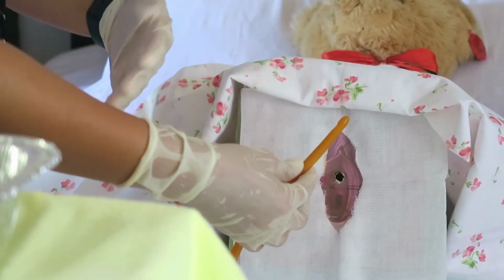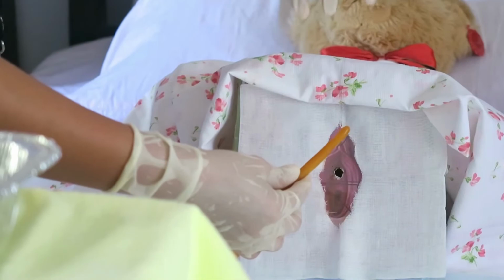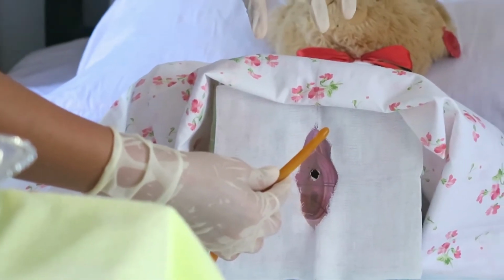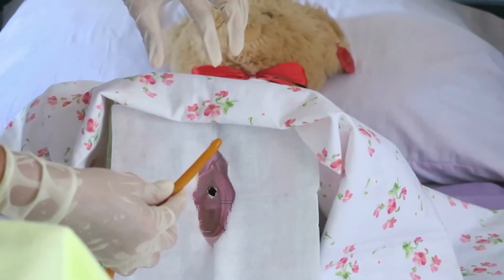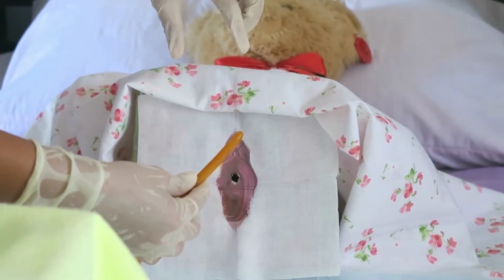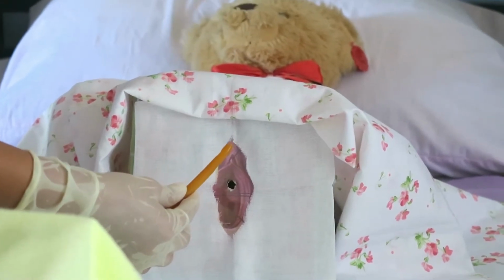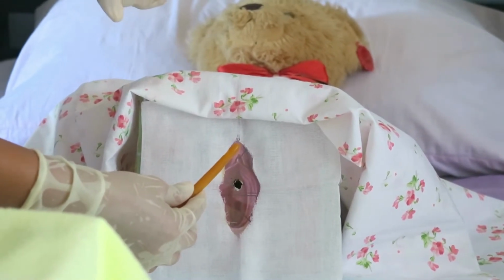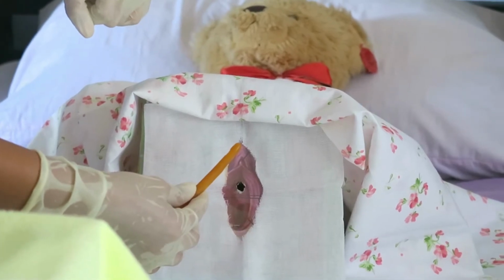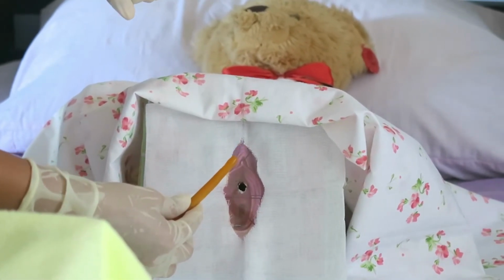So after that, insert the catheter into the meatus for 2 to 3 inches or until urine begins to flow, and if a specimen is to be collected, pinch the catheter with the thumb and the finger while placing the specimen container in a position. The rationale for this is urine will flow out of the catheter if the lumen is not occluded. Thus, the purpose will be defeated and maintain sterility.